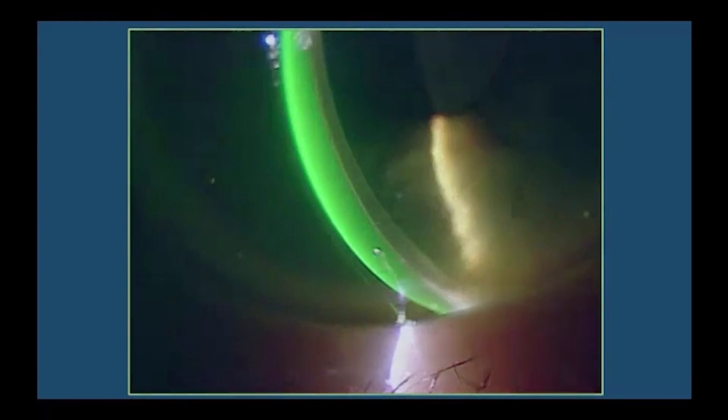Evaluating the clearance over the limbus is important when fitting scleral lenses. If there is any sign of the lens contacting the limbus, the limbal transition zone needs to be modified accordingly to eliminate that contact. The ideal fit should demonstrate limbal clearance.